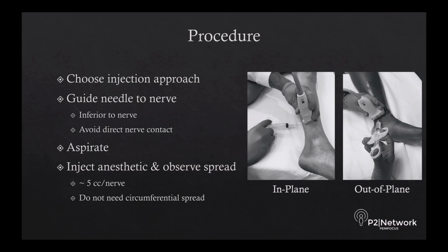As you can imagine from the image on the right, with this orientation, you have very little room to bring your needle in from the posterior or anterior approaches, but you may be able to come in with an out-of-plane approach, similar to if you wanted to cannulate a vessel in that area.